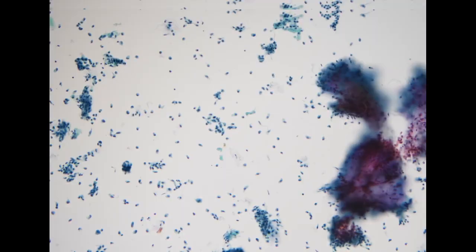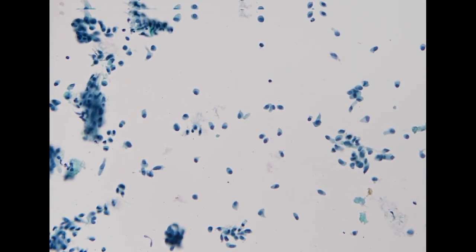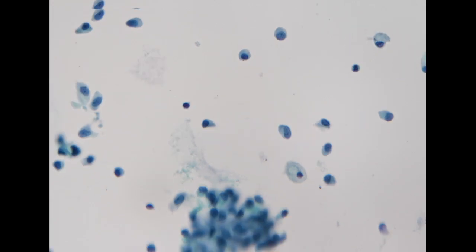Next specimen is also a parotid aspiration specimen coming from a 60-year-old female. So this is a totally different tumor. Just on low power, we can see some bluish material, bluish stroma. So these are chondromyxoid matrices. And in the background, we have a lot of single cells. We don't have a cystic stroma, we don't have lymphocytic cells in the background, but we have these cells mostly in oval shape, some with a single cell plasmacytoid appearance. So these are all myoepithelial cells.